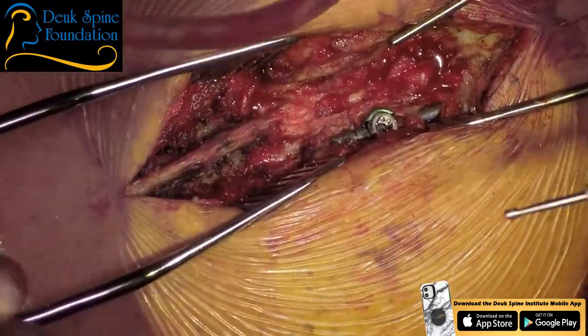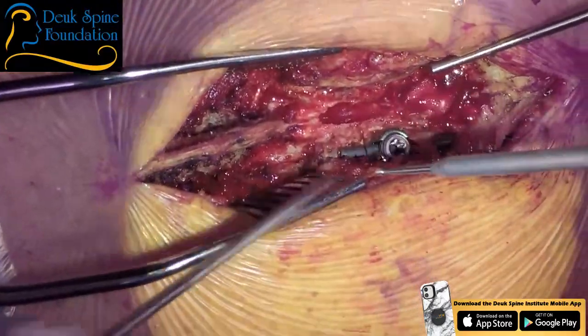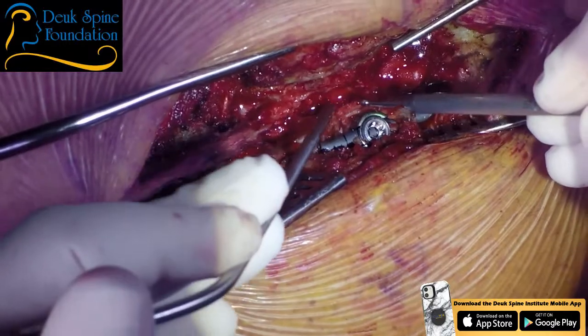Have that. What is all this curly Q? Looks like a French fry. Please get this out of the way. You should never have that many curls in your suction line. That's just, I can't even tell you what that is.